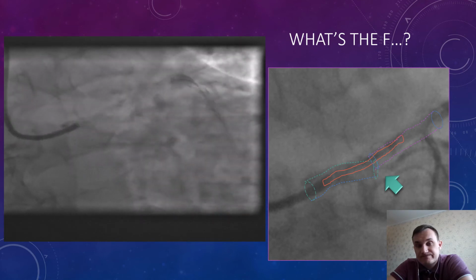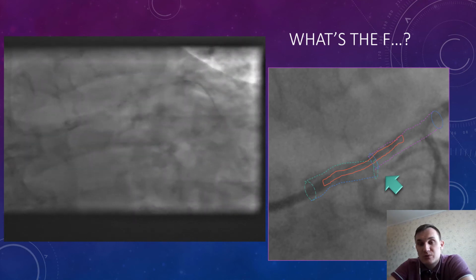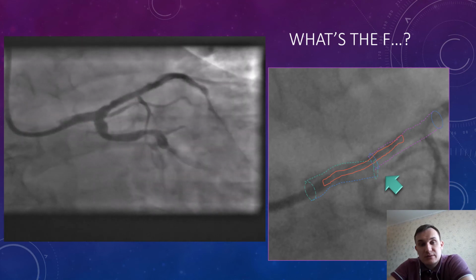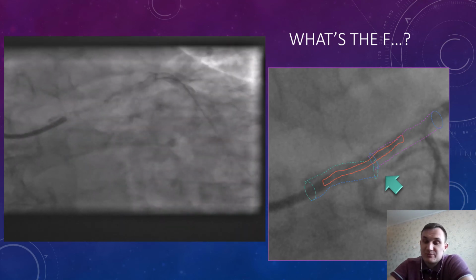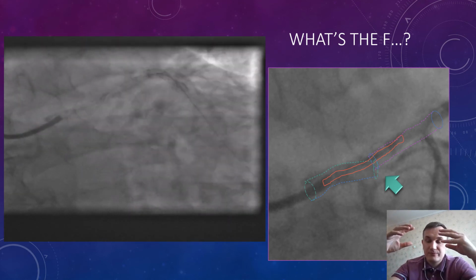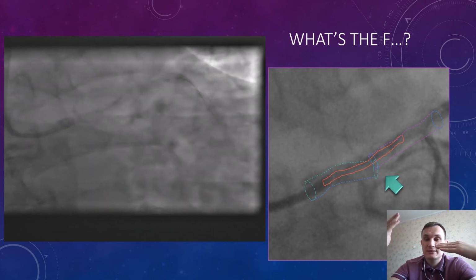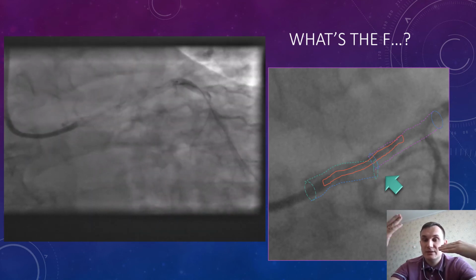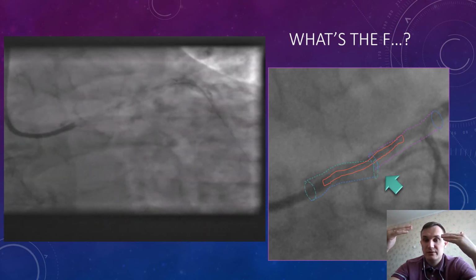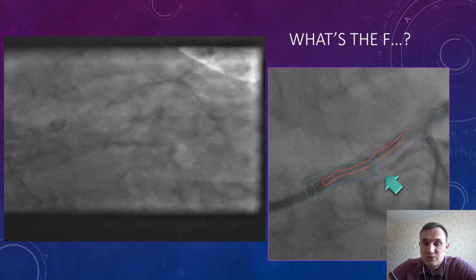You can see that our last implanted stent is kind of opposed to the LAD, and I don't know how to describe it properly, because you can see a not coaxial alignment of the stents, the previously implanted stent of the LAD. I mean, this is a stent which was implanted in 2005, and our current stent. And what to do in this situation?